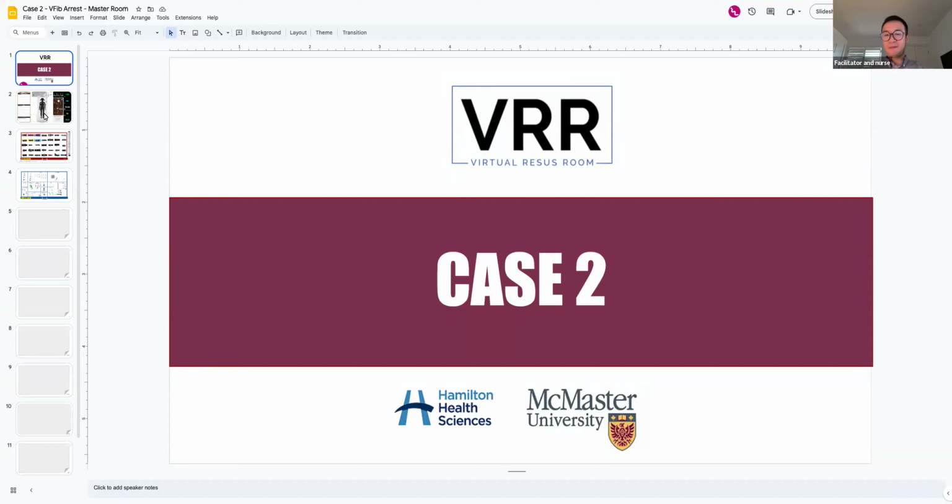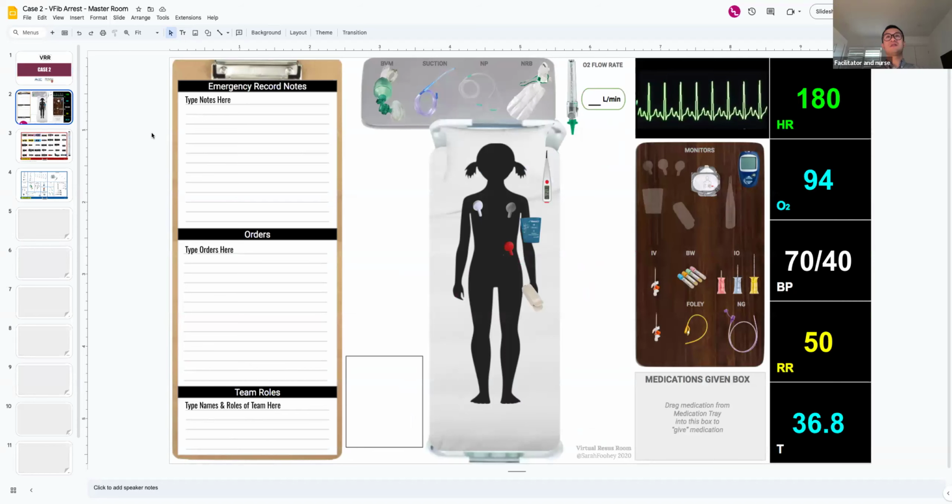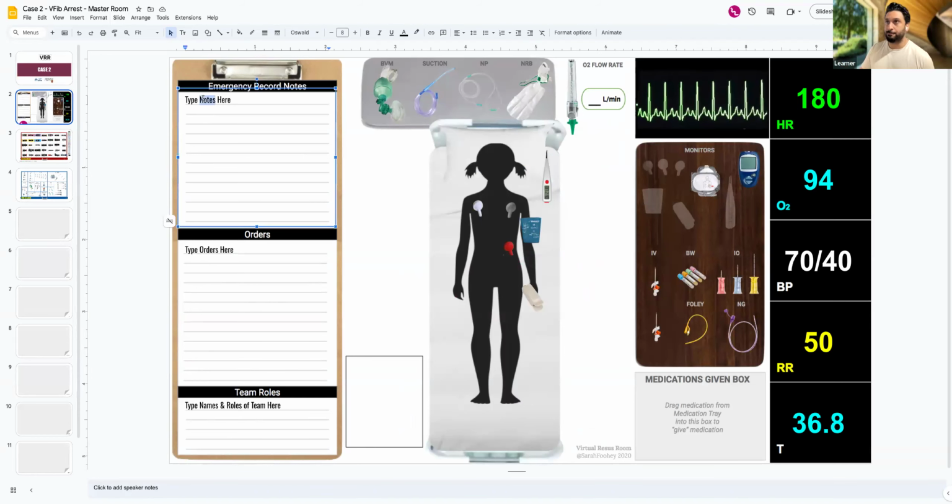Okay, are you ready to proceed? Yep. Okay, so we'll start the resuscitation. I will be playing the role of a nurse. Okay. Hey everyone, I was called to this room. My name's Dr. Lerner. I'll be leading. Can you tell me what's been going on?